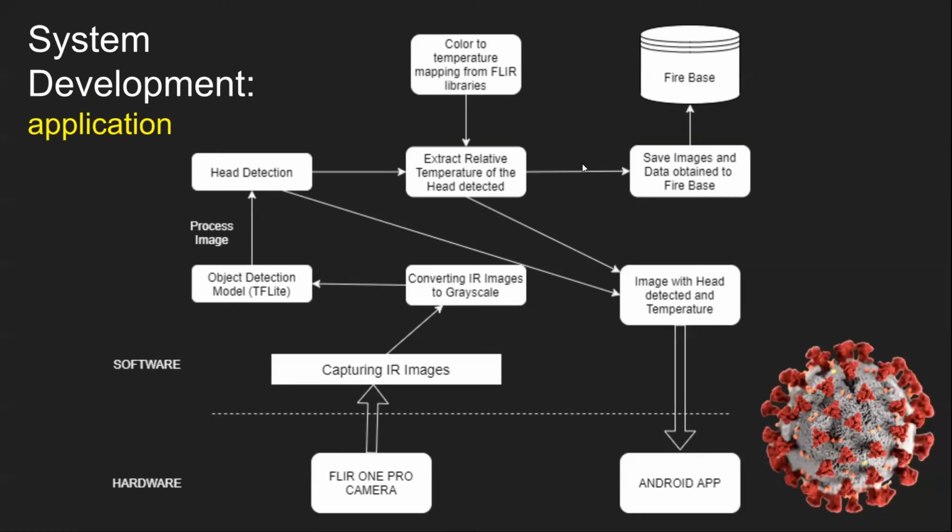These records are then passed to the Google Firebase backend, where they can be used to populate the maps interface we saw earlier. Additionally, those same head detection regions, along with the temperature and risk information extracted, are used to provide the user with a live video feed to visualize possible fever instances around them from within the COVID ID Android application.